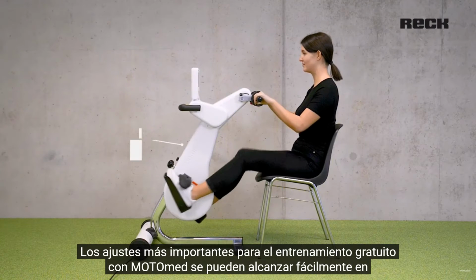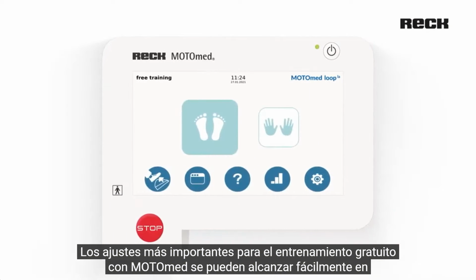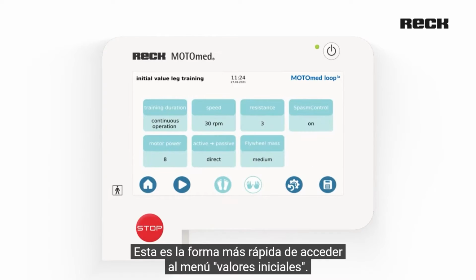The most important settings for free training with the MOTOmed can be reached easily in the home screen by briefly pressing and holding the active training mode. This is the quickest way to get to the Initial Values menu.